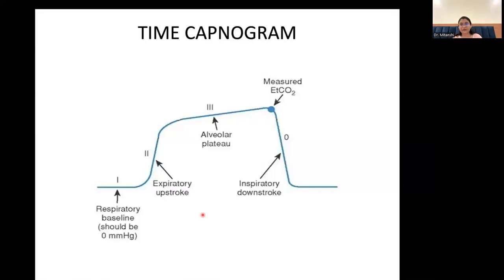Now, the time capnograph. This is a very important capnograph that is asked in your NEET PG. NEET PG examinations always ask you one or two questions related to capnography, and you have to know all the waveforms that show different pathologies and their capnographic depictions. So I want you to understand first a normal capnograph. How does a normal time capnograph look?